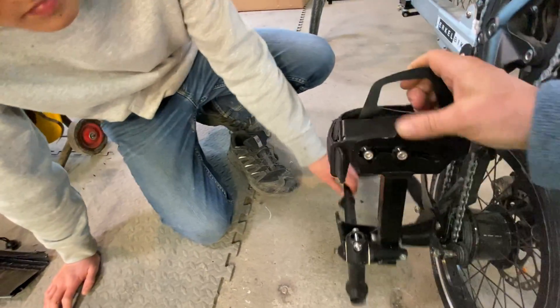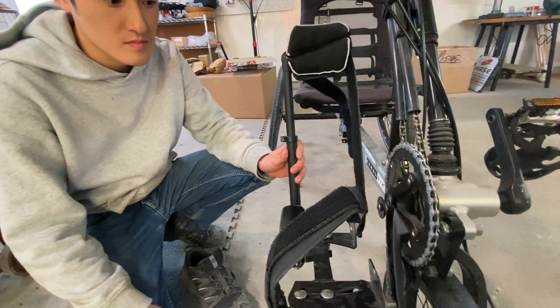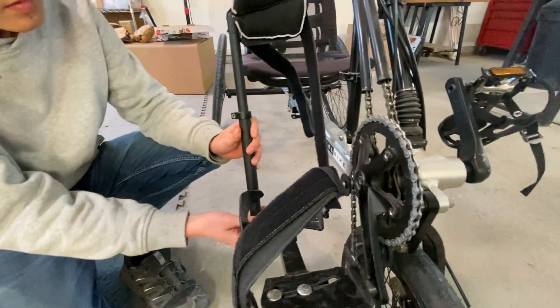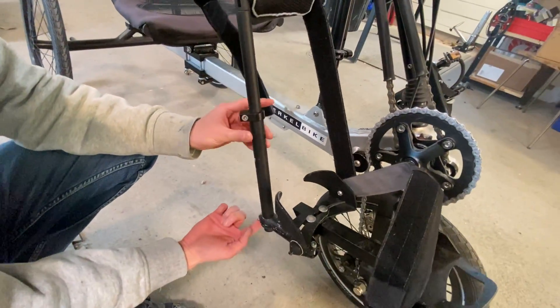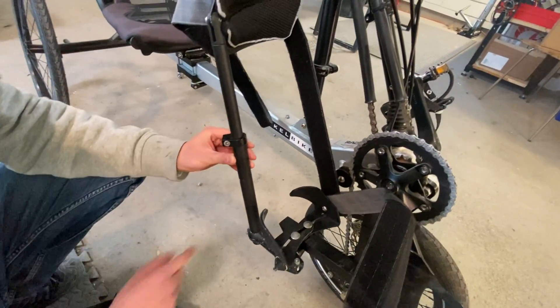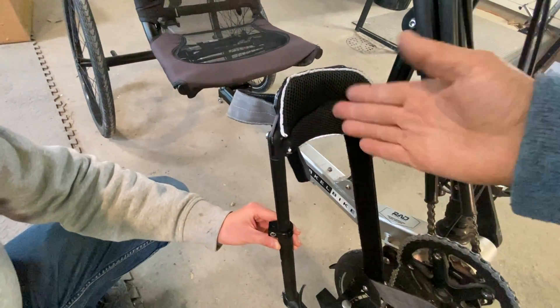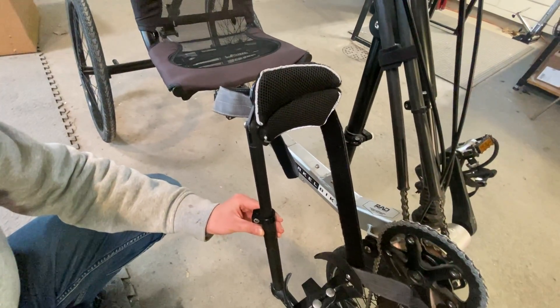You can also adjust the height of the calf support to the point where you need it and where it's comfortable. There are two adjustment points for height: one down there and one on the left-hand side. This pad can also be adjusted either to the outside or to the inside, depending on where you need it most.